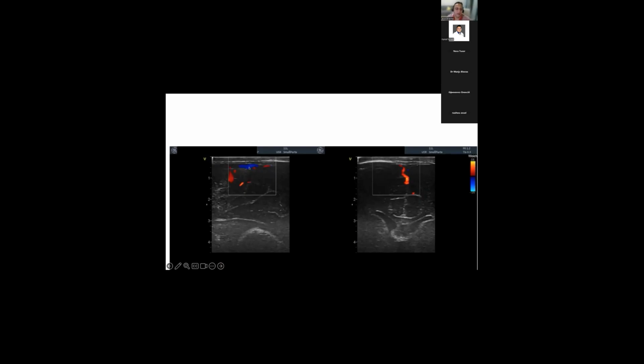And then we look at the sinuses for every baby. Beautiful. For this, we use the linear probe. Very nice images. There's nothing to critique over here. I can see that you're using the linear probe to get these images. Yeah. So that's all. Well done.